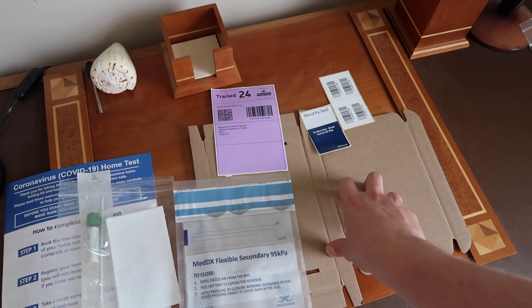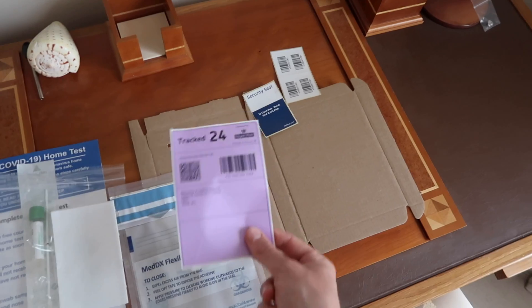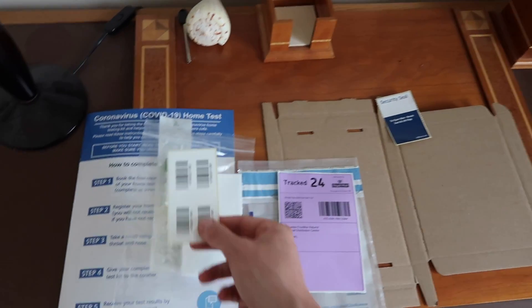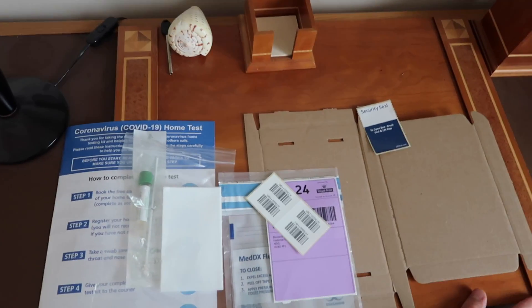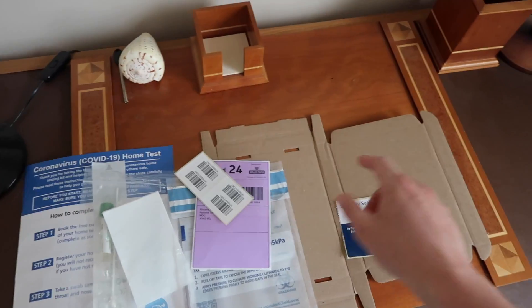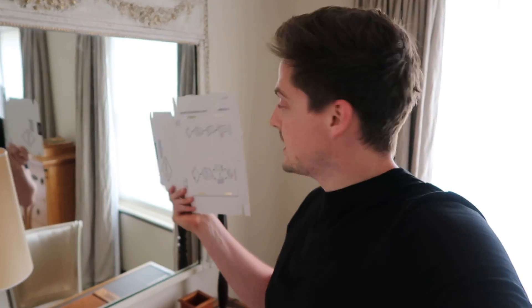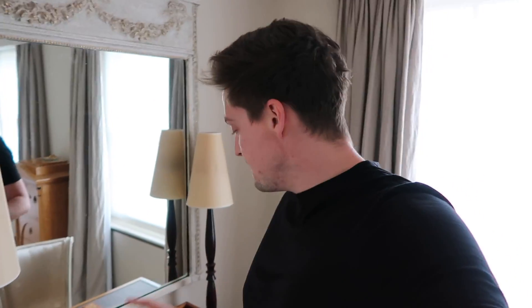The absorbent pad and swab kit go into a larger bag that you can seal. You have a box to give to the courier along with a label to stick on the outside. You also have barcodes to stick onto the actual test tube to identify it, and one goes on the outside of the bag too. There's also a security seal to seal the bag. The most difficult thing in this test is probably making the box — at least there are instructions on the back!